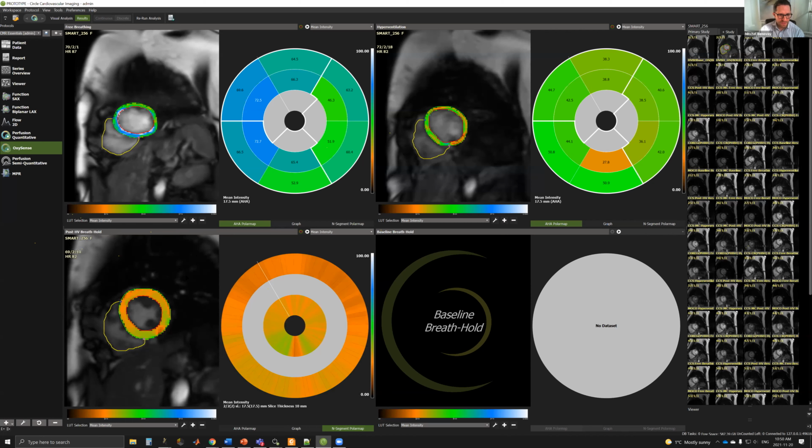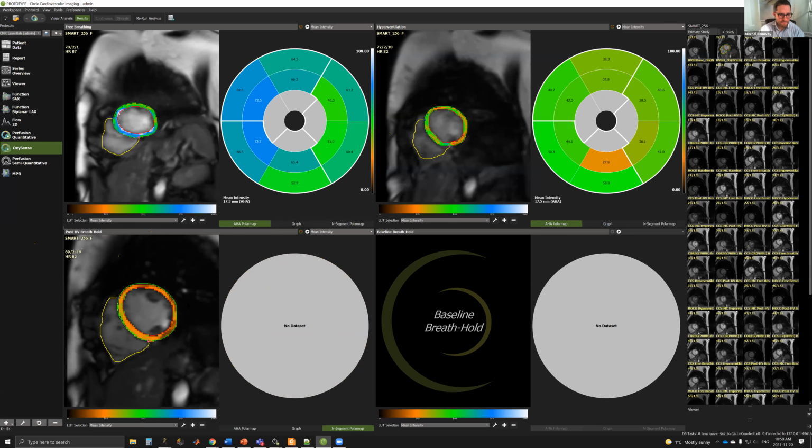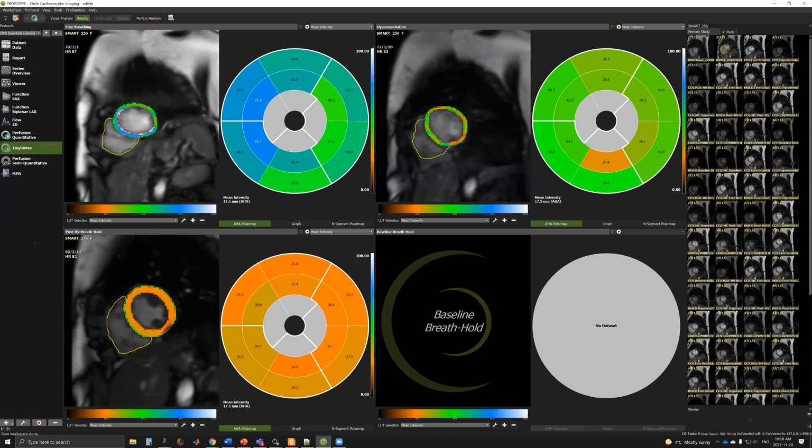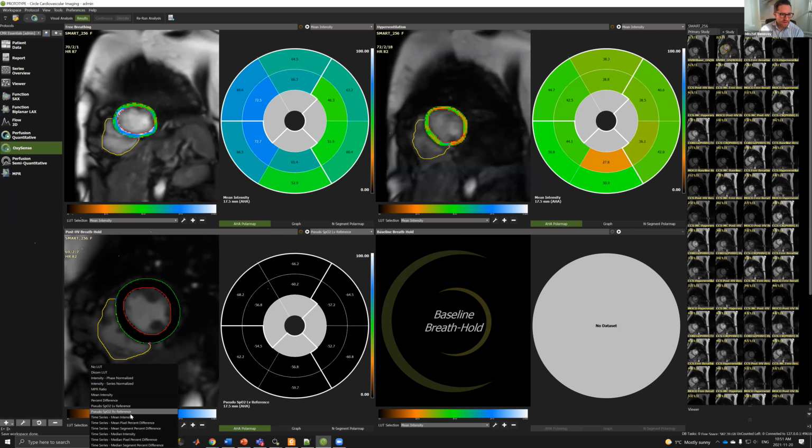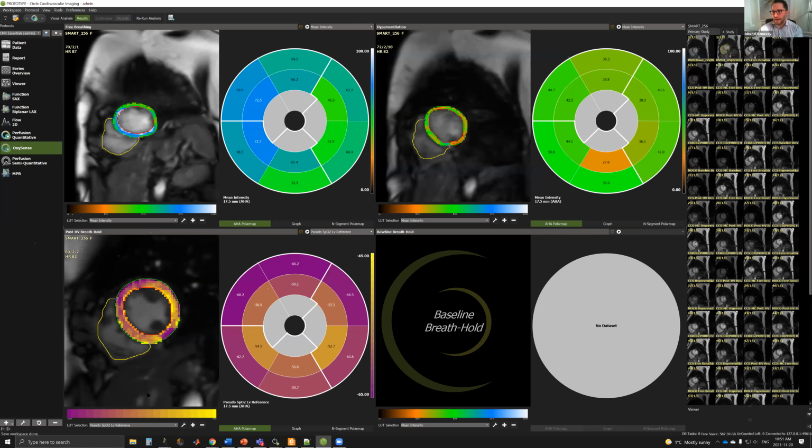We also have a higher resolution polar map. This is a 100-segment map, perhaps a little more robust to partial volume effects. But for me, the nicest and most interesting one is the dynamic polar maps, and these are very cool. You can select down here which biomarker you want to look at. So let's select our pseudo SpO2 biomarker. Down here are the lookup tables. You can customize your lookup table, and you can add new ones, whatever suits your fancy.